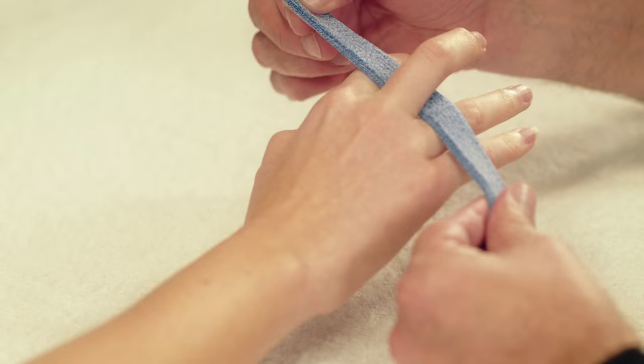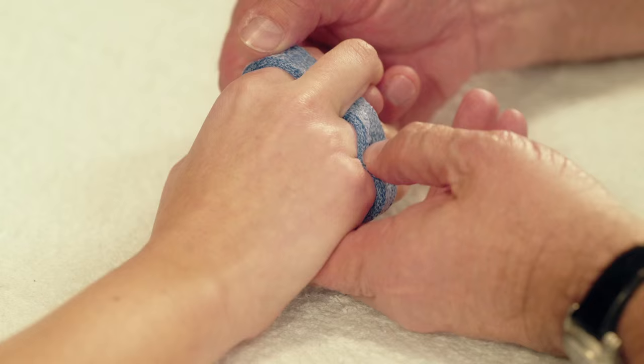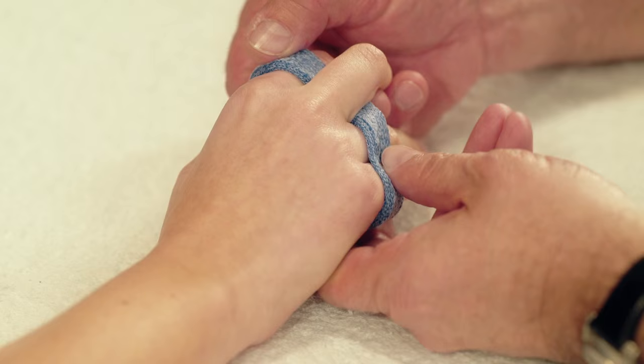Wrap the Orficast around the first phalanx of the middle finger. Wrap the edges of the orthosis towards the palmar side of the first phalanx of the index and little finger.